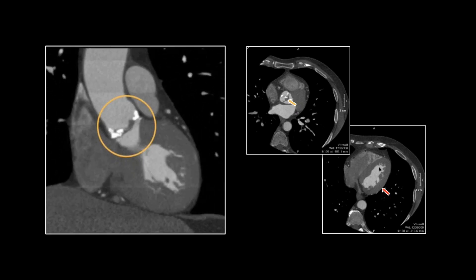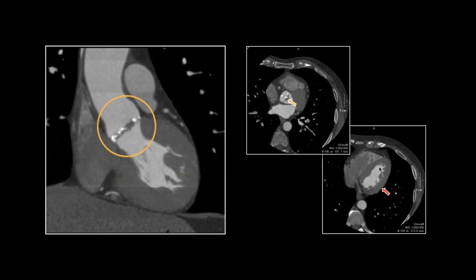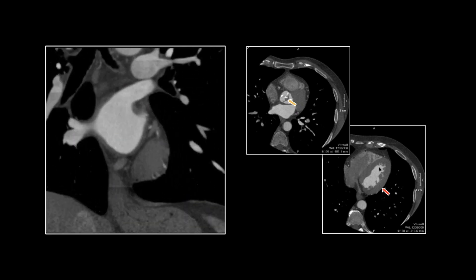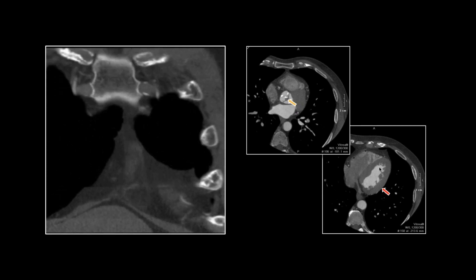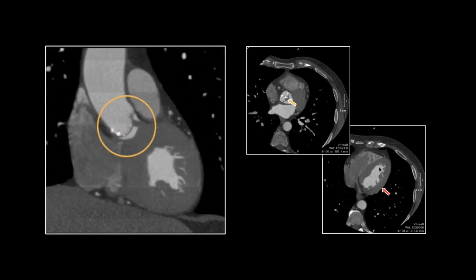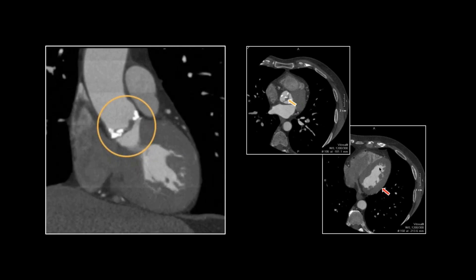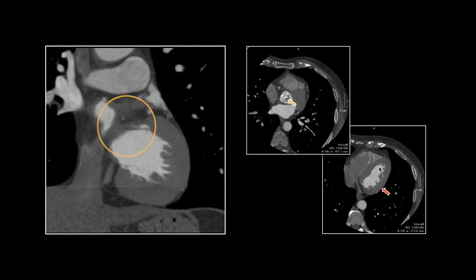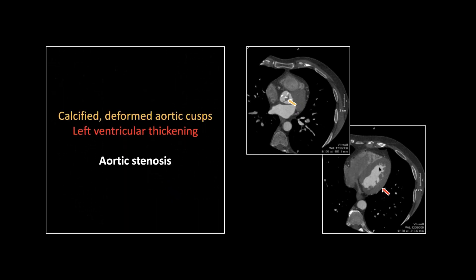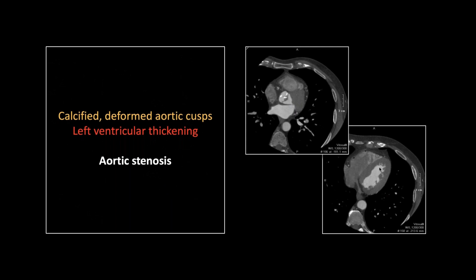There it is on the coronal. Really appreciate the LV hypertrophy, also the thickening of those cusps and their apparent fusion. So that's an aortic stenosis.